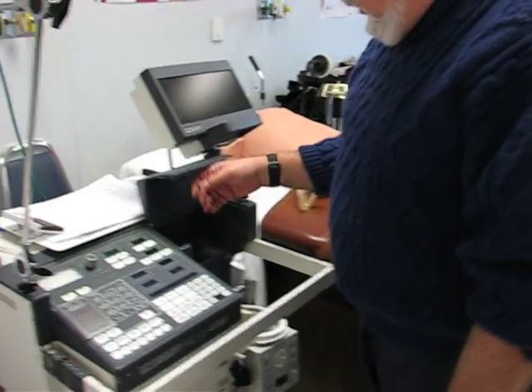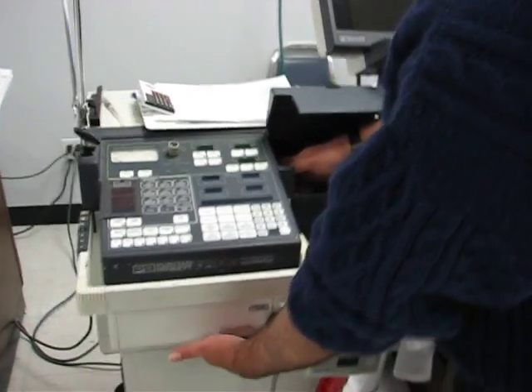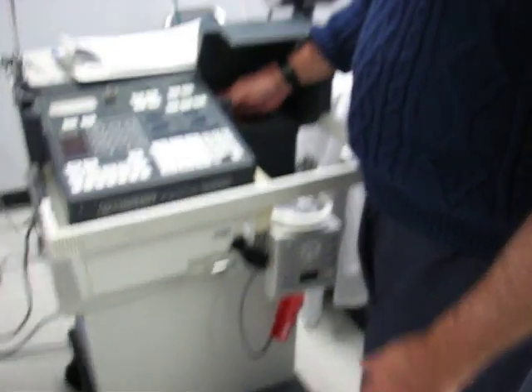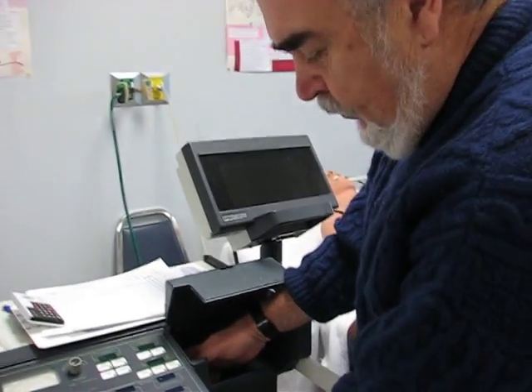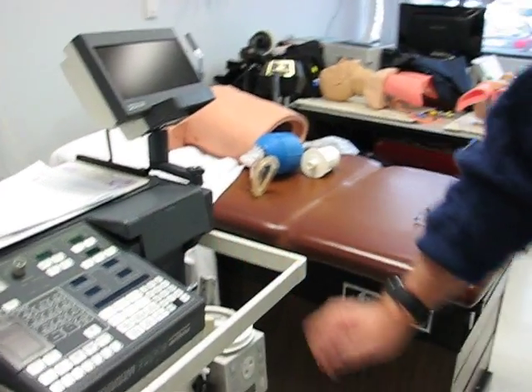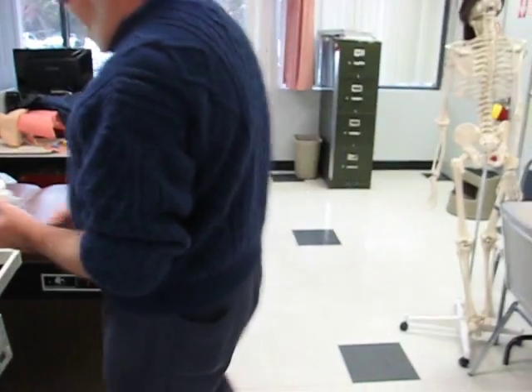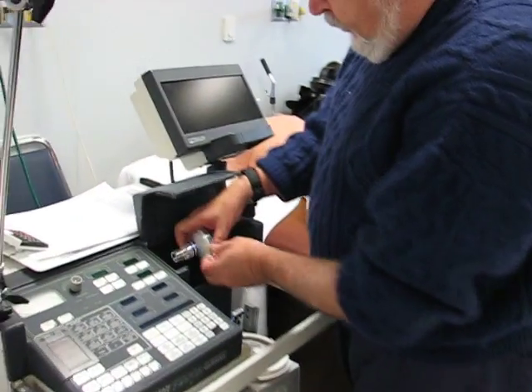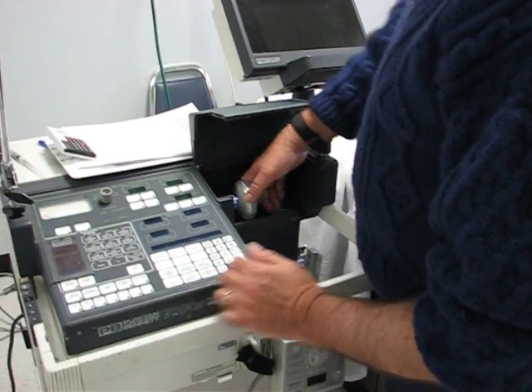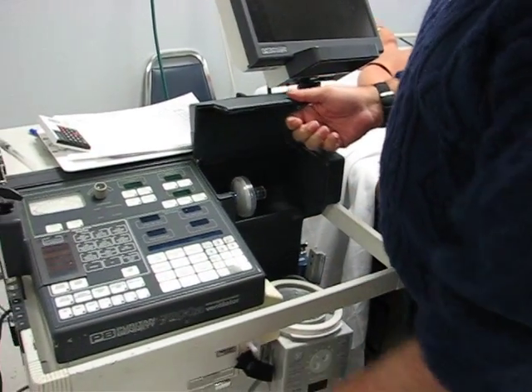First thing to do on the machine is make sure that your filters are installed. We're going to leave the expiratory filter in there because it's about to fall apart and I don't want it to break, so we don't have to worry about that one. But the inspiratory filter will need to be put on. I come over here and find it — it will fit only the right way. So if you put it in and it doesn't go on, then it's the wrong way. Once you have that on and the expiratory filter is on, you're ready to put the circuit on.